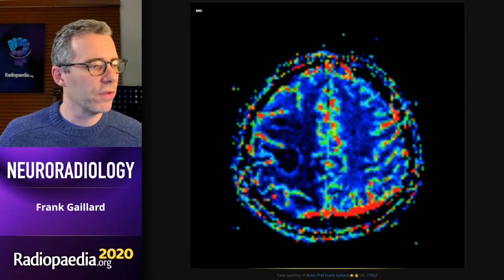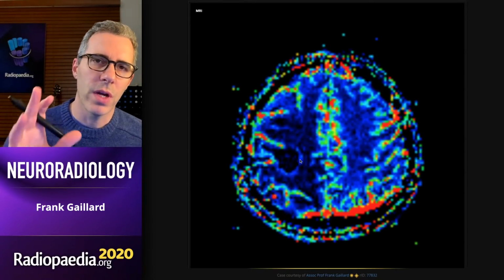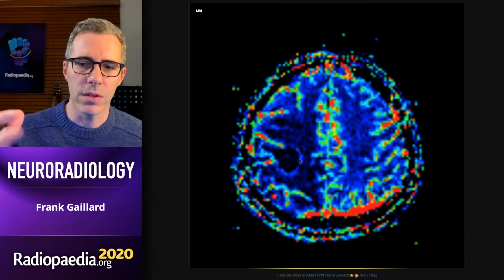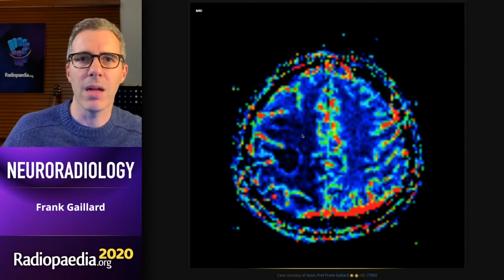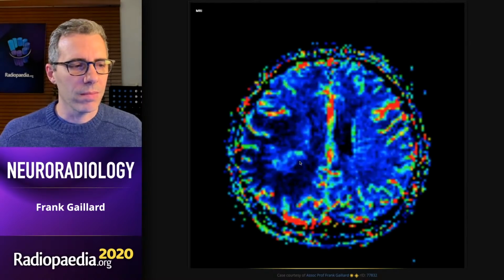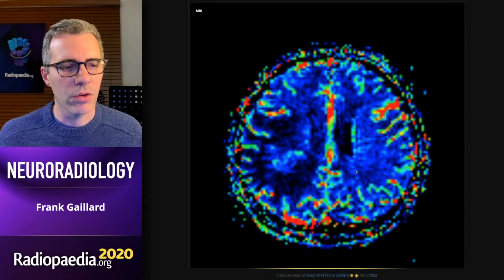If we move to perfusion, we see that a lot of this peripheral ring enhancement doesn't have very high values. Remember that what you're trying to compare to primarily is normal contralateral brain, not the surrounding brain, because here we have very depressed CBV, because all that brain is swollen apart by water, which is not perfused. But when we come inferiorly, we see that solid, more nodular component, especially this bit that's creeping towards the lateral ventricle, has increased CBV, higher than the contralateral side.